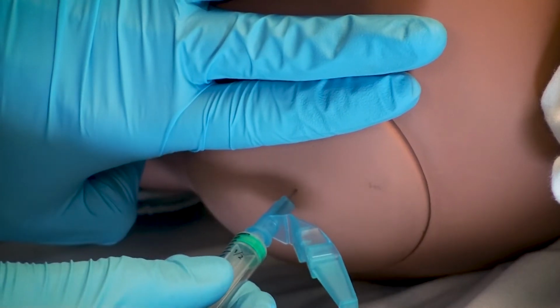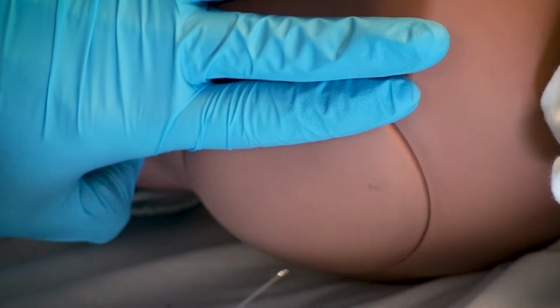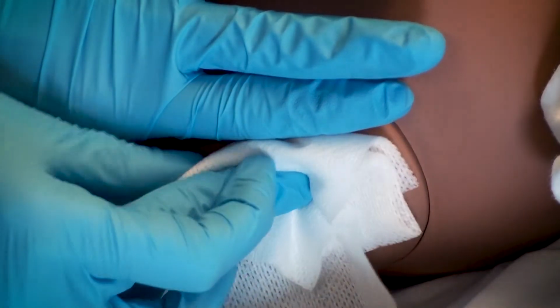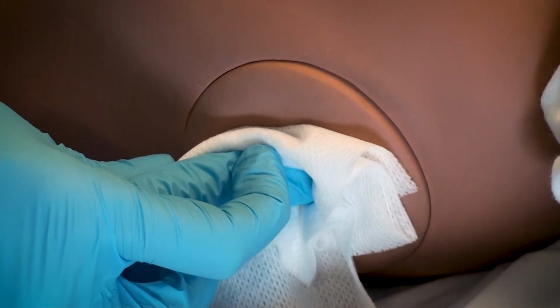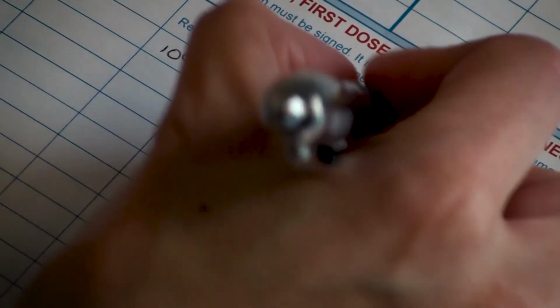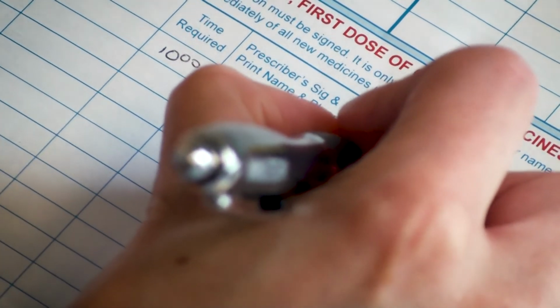Once the whole drug has been administered, withdraw the needle safely, close the needle safety device if using, and dispose of the needle in the sharps bin. Apply gauze and pressure to the site and check for any bruising or bleeding. Ensure that the patient is comfortable. Explain to them any adverse reactions and any aftercare advice they may need, and ensure that the procedure is documented on the drug administration chart and the patient record appropriately.